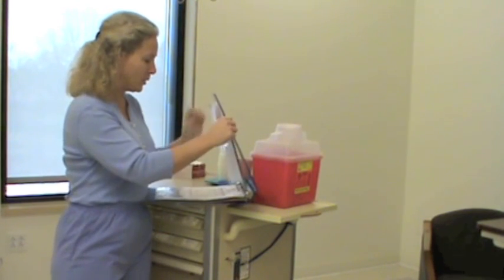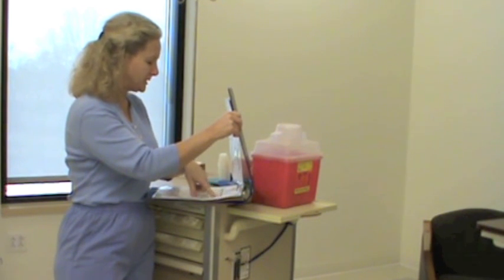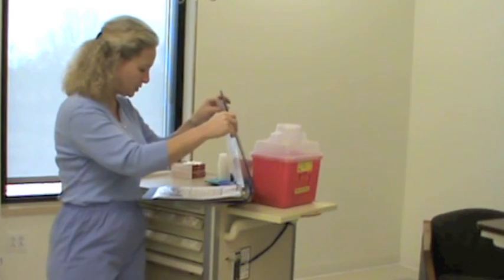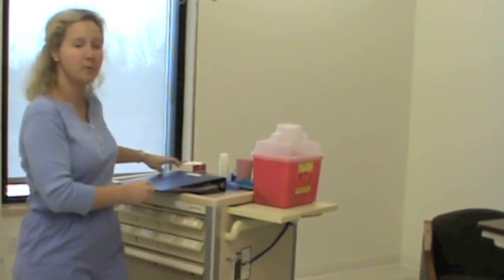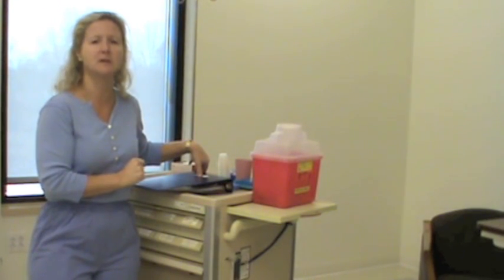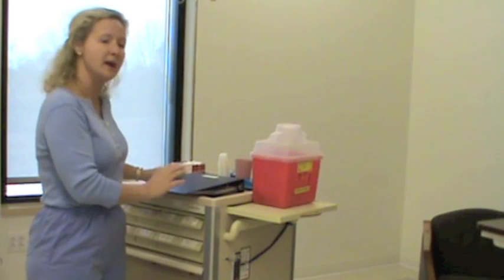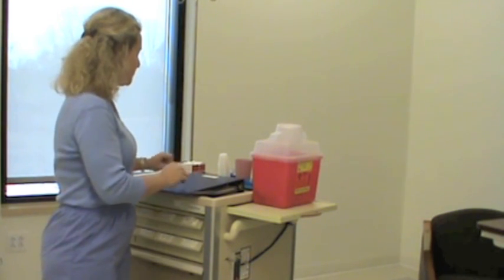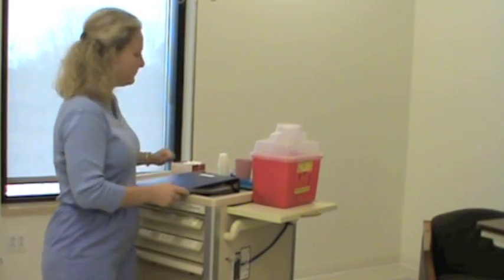I have Morgan Brown's medical record number and her date of birth 8-4-1970, and she is allergic to morphine. I have to check allergies because in my kit I know that I have latex products and the cleansing contents has iodine-based solution, so I want to make sure she doesn't have any allergies to latex, shellfish, or iodine. I'm going to take a label from the chart so that I can identify Mrs. Brown.